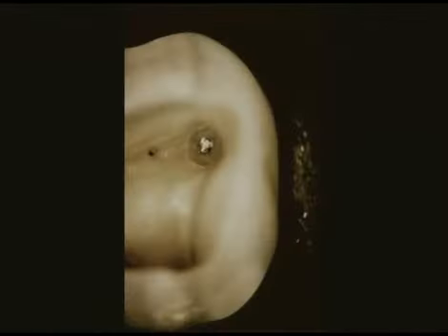A clinical photograph demonstrates straight line access and complete visualization of the broken instrument. Notice the circumferential staging platform to facilitate ultrasonics. This was accomplished with an appropriately sized, modified GG. Notice also the previously untreated MB2 orifice.